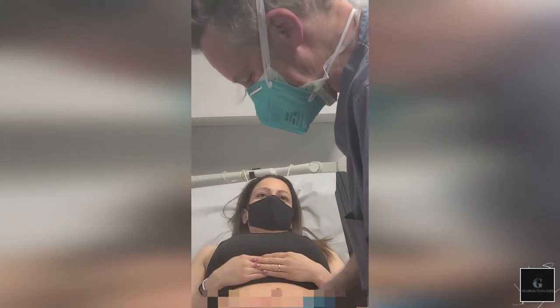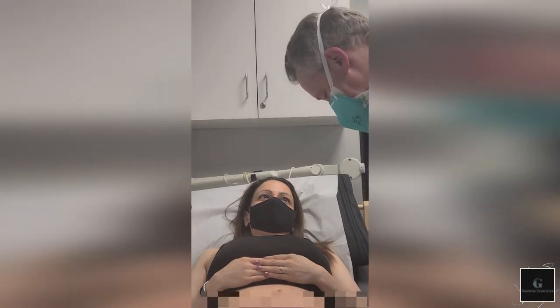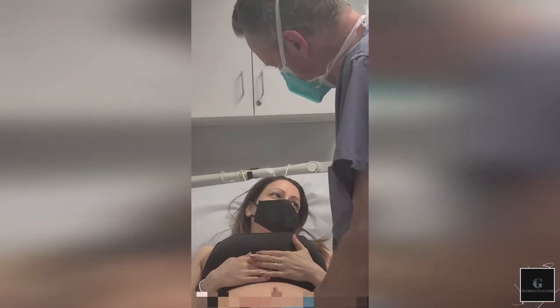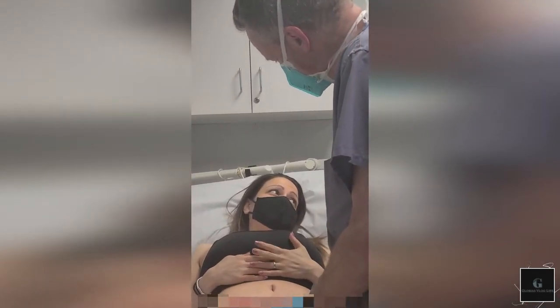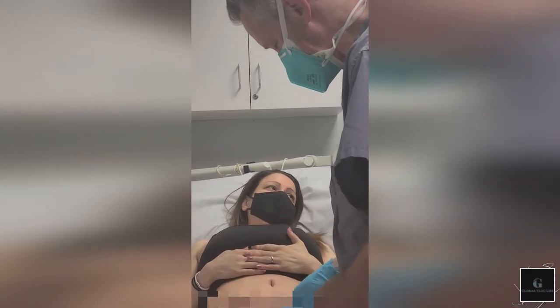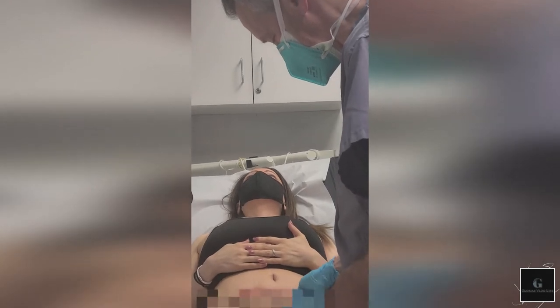Now, you're going to count for me: one, two, three, and when you say three, I will pull the drain. You're going to be fine. So you count it down: three, two, one. Feeling fine.